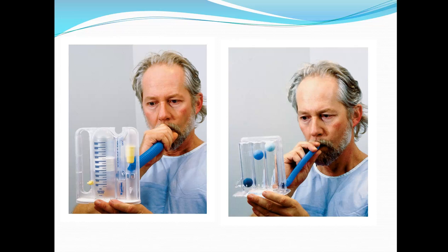All right, and these are a couple of pictures of some different ones you might see. The one on the left is the one they have at St. Bernard's. This is just important to know how to teach the patient to use this correctly.